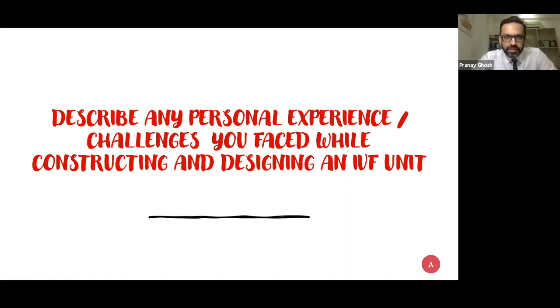So as a takeaway from my time spent in the biochemistry lab and doing ELISA testing, I found it useful to have any reading done in triplicate. So have at least two sets of quality control equipment so that you can do a triplicate of study values, and you can match it with the values that come across from the QC engineers.